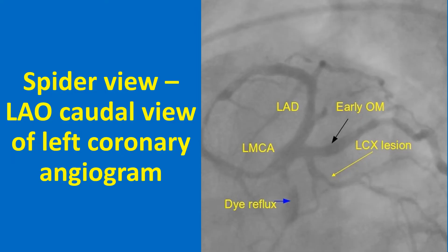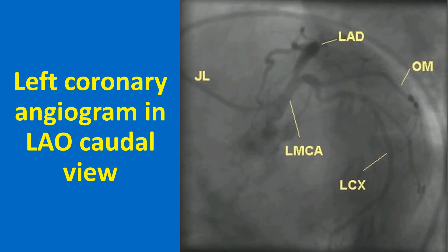Absence of dye reflux would indicate left main ostial disease or rarely spasm. This is a left coronary angiogram in LAO caudal view in another case, with the JL Judkins left coronary catheter visible. Differences in coronary orientation can be due to anatomical variations or mild changes in angulation used. X-ray penetration is less in LAO caudal view, especially in obese individuals. In this view, the mid segment of LAD is foreshortened and this view should not be used during angioplasty of the mid LAD.